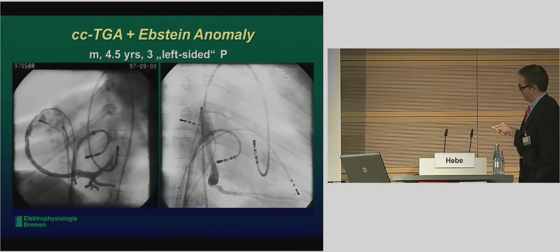And after 2 sessions, we found out via a coronary angiogram that the coronary sinus in this patient, we are looking in an LAO view now to the heart, took a very anomalous way. This is around the left-sided tricuspid valve annulus. Here's the interatrial septum where we were used to the coronary sinus being connected towards the right atrium, but it takes another longer distance and ends up here right anterolateral into the right atrium.